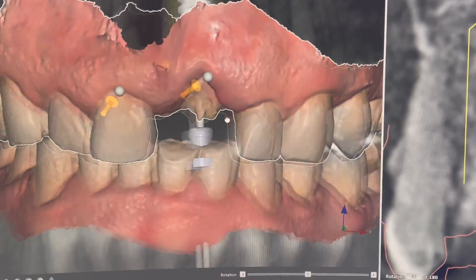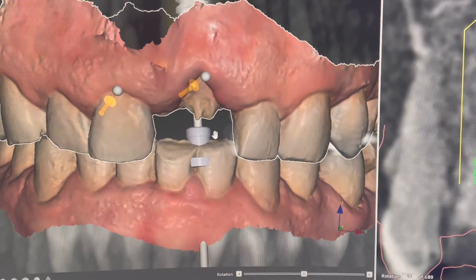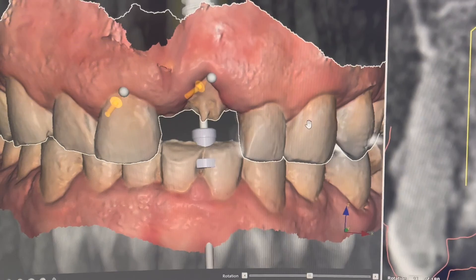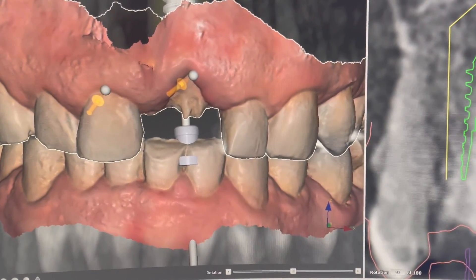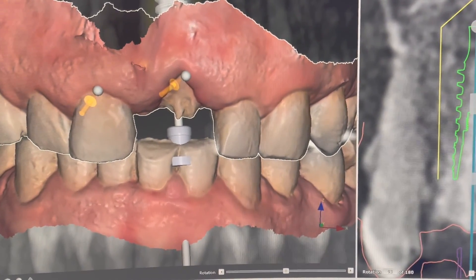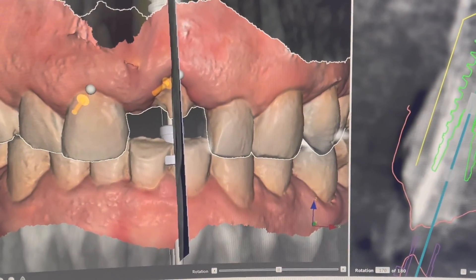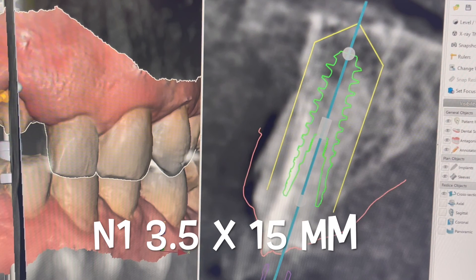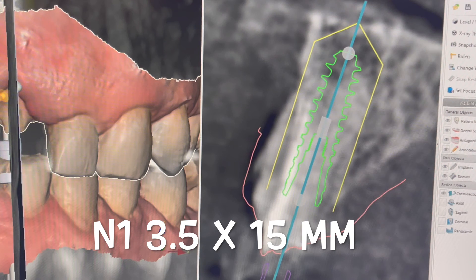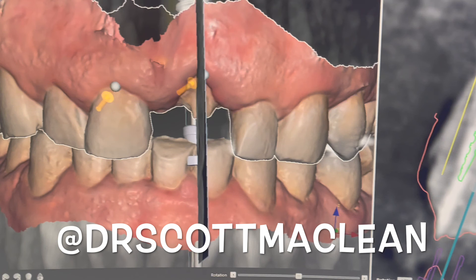Teeth 8 and 9 are having a problem here. The 9 is coming out, so we're planning the implant. We actually did submerge this implant, did some bone grafting, let the tissue heal over the top, then came back and placed an anatomic abutment. The implant was positioned right here, which gives us some jump gap grafting and also lets the soft tissue come forward — we covered the soft tissue and brought it down a little bit too.